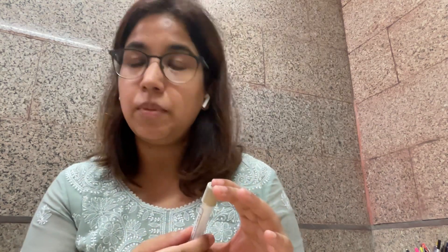The grey top vial contains two things: sodium fluoride and an anticoagulant, which again could be dipotassium or tripotassium salt of EDTA. The role of sodium fluoride is to inhibit glycolysis. We use this vial for plasma glucose estimation, since plasma is the most preferred sample. When a sample is taken in this vial and left at room temperature, the plasma separates out and can be used for glucose analysis.